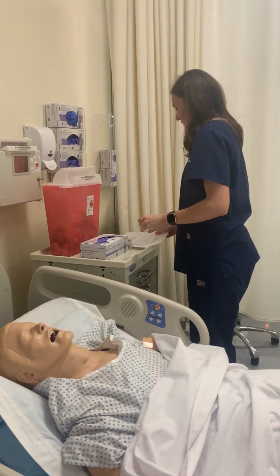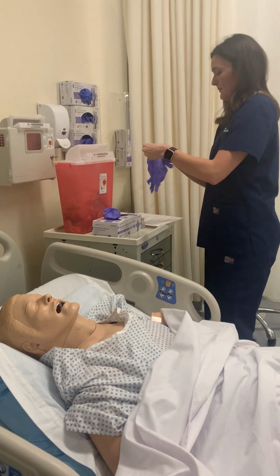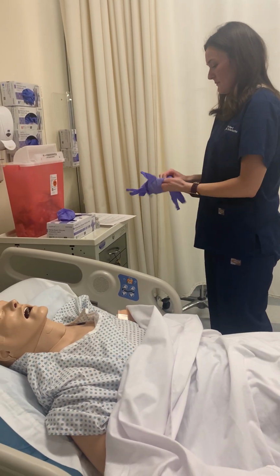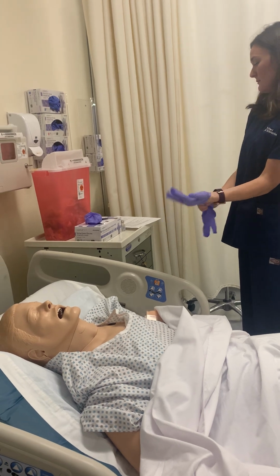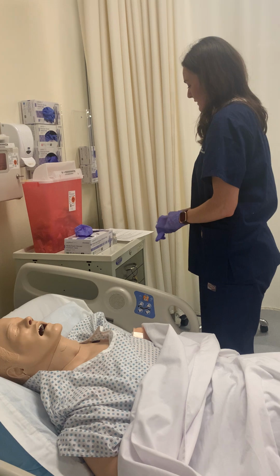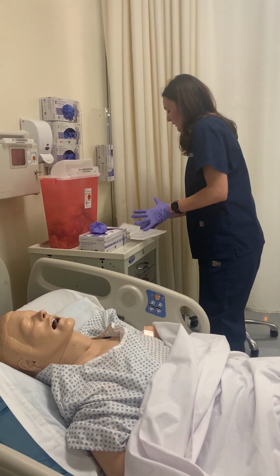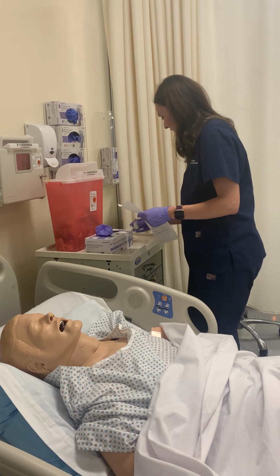Okay, so I am going to apply my gloves. I'm going to go ahead and do my third med check. We've got Joanne Peterson, very nice.